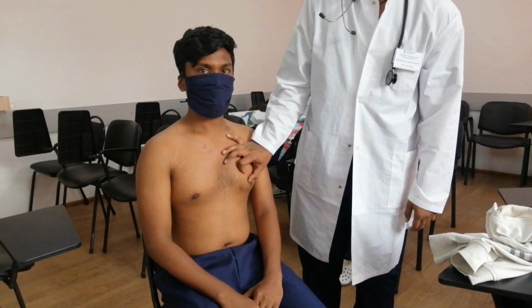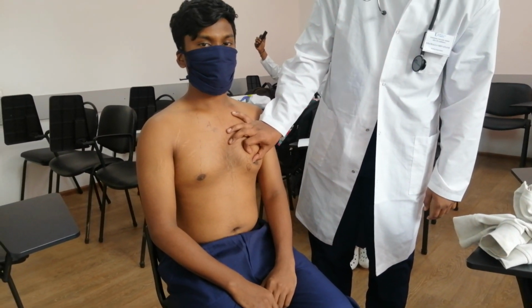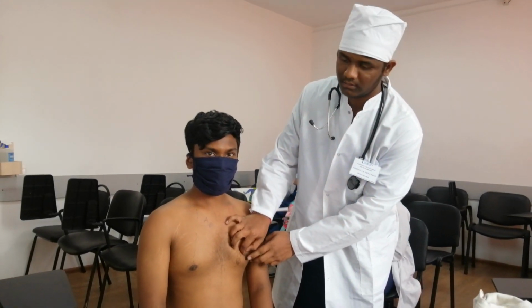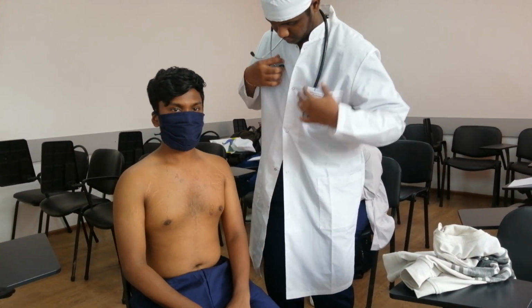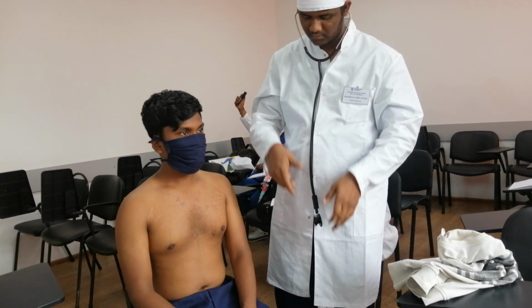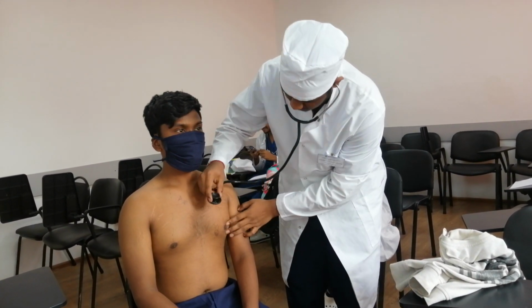And the 5th intercostal space, inside how much? Inside 1.5 centimeters we have the mitral valve. Okay, listening. Check your phonendoscope, which side is good for listening. Okay, put.